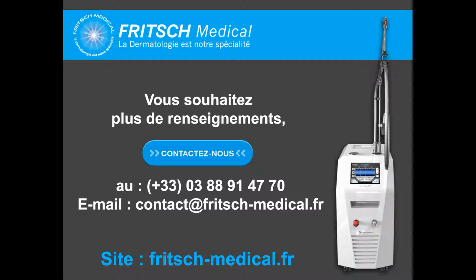Sometimes for leg telangiectasia, when you use the 1064, on the first pass the vessel doesn't disappear. You just induce a small edema inside the vessel. So you shoot on the legs and you see nothing, but you go to another part of the body, and you come back a few seconds later, around 30 seconds after the first shot, and repeat at the same place.